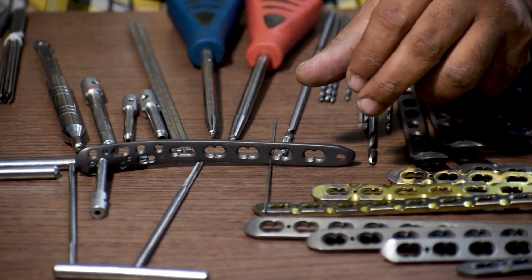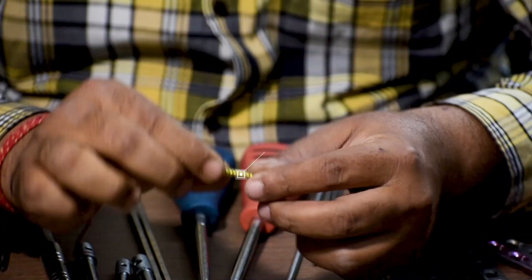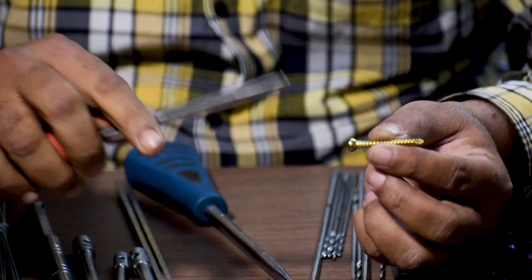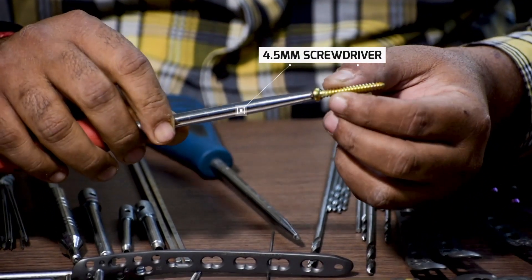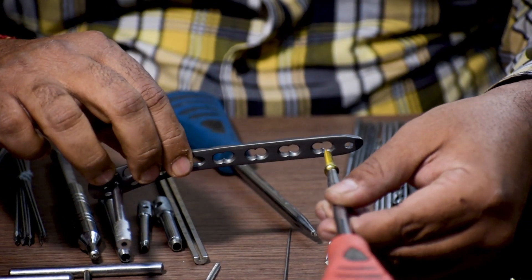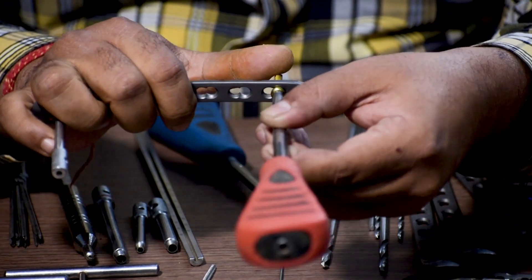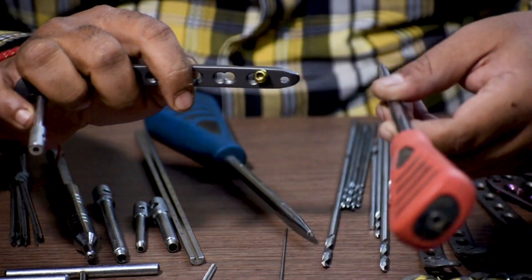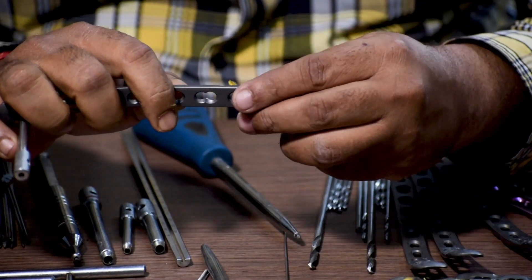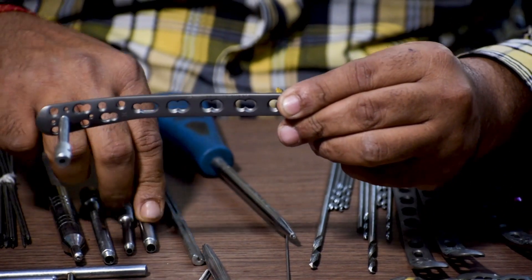After this, a 4.5 mm cortical screw will be inserted. This is a non-locking screw, fixed with the help of a 4.5 mm screwdriver. This will be inserted in the non-locking hole where it was already drilled and tapped. In general, a non-locking screw is attached first so that the plate gets connected with the bone, providing compression.